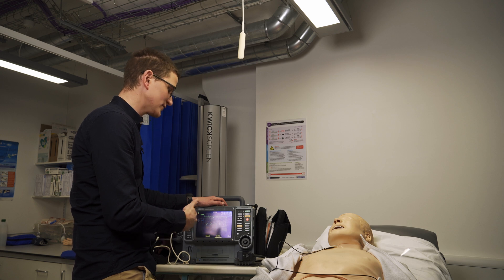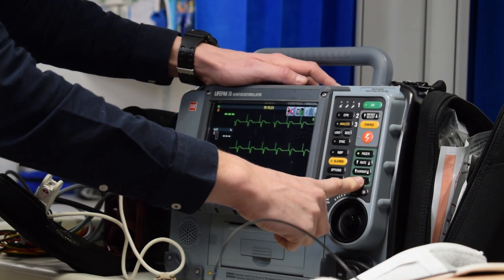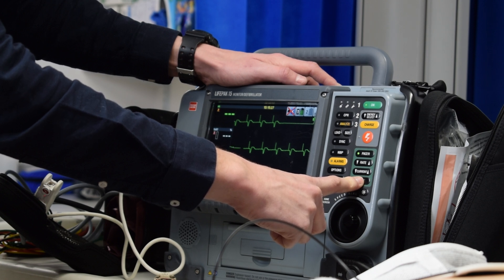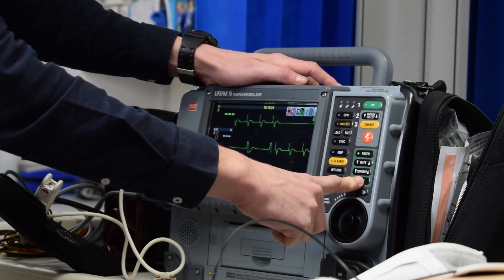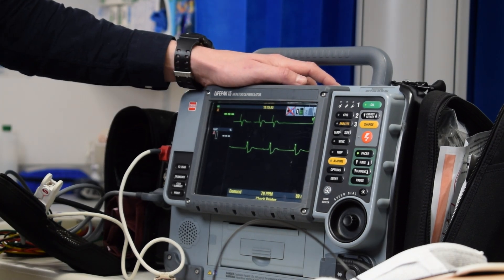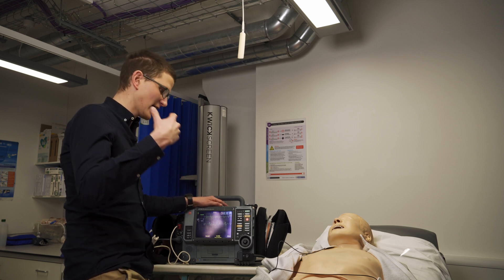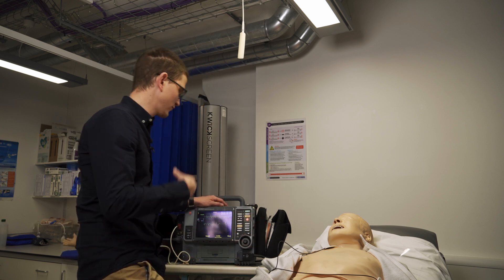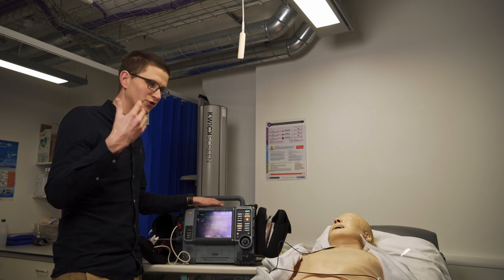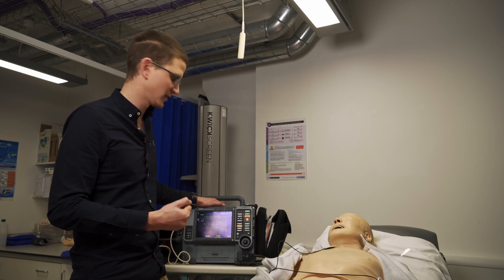If you want to see the underlying rhythm, there's a pause button at the bottom. Hit pause to stop the pacer temporarily, get a printout of the underlying rhythm, then let go and it starts pacing again. That is how you pace with a LifePak. Any questions or different thoughts on how you do it, I'd love to hear. If you enjoyed this video, I've got tons more — thanks for your time, bye for now.